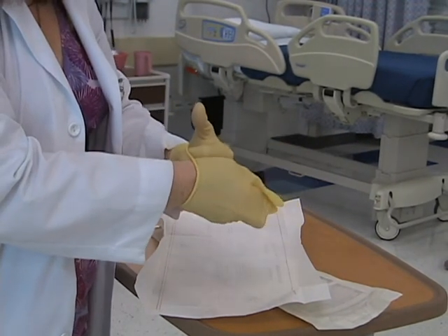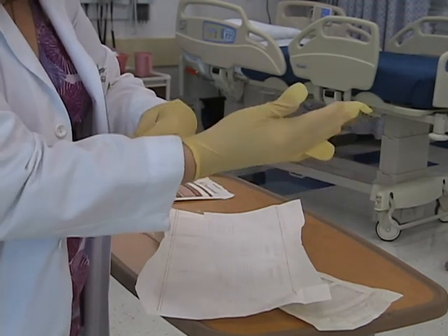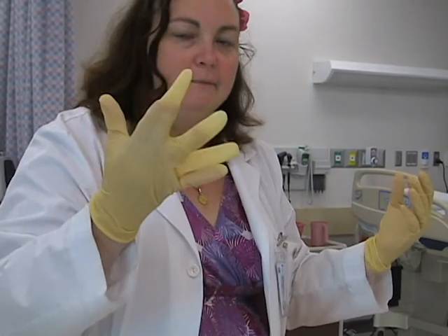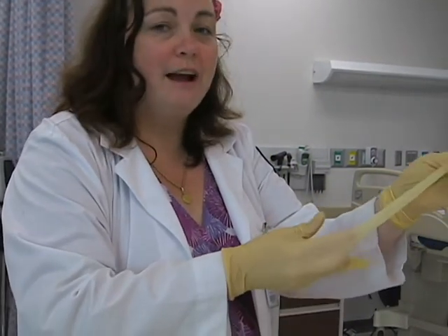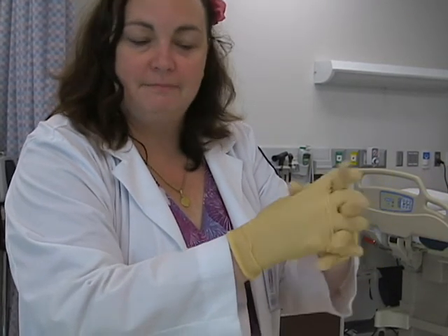Now, let's say we have a situation where two fingers are bunched together like this. Don't panic — it's okay. Gloves do stretch, and you can adjust the fit. There we are, sterile and ready to go.